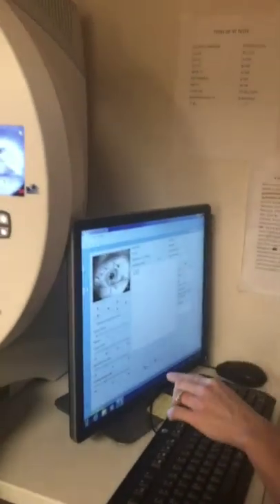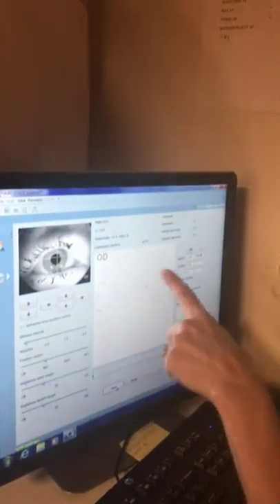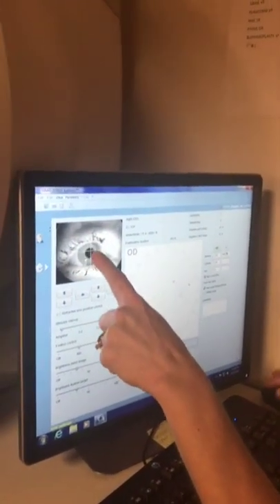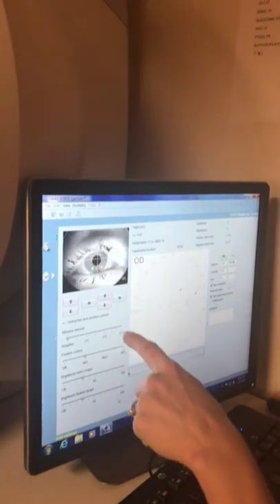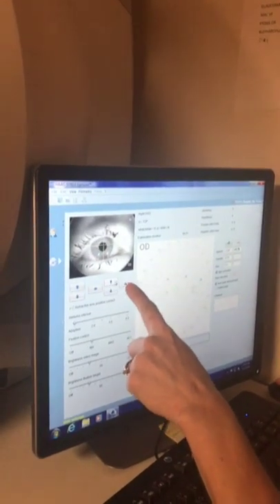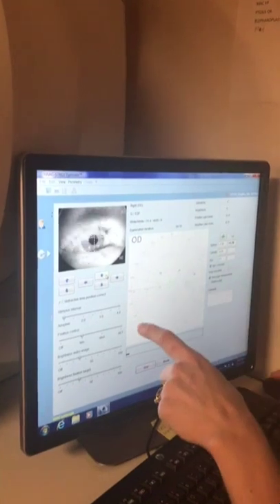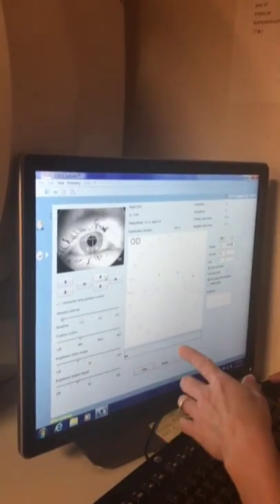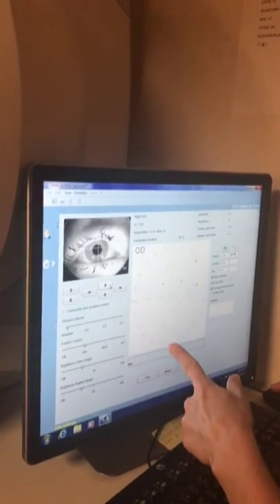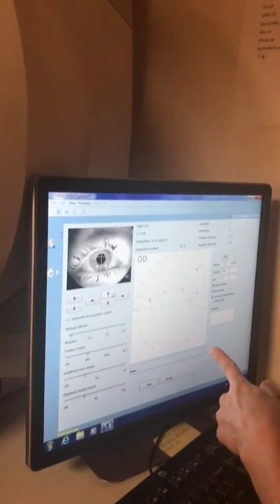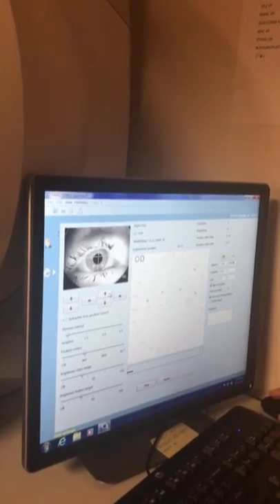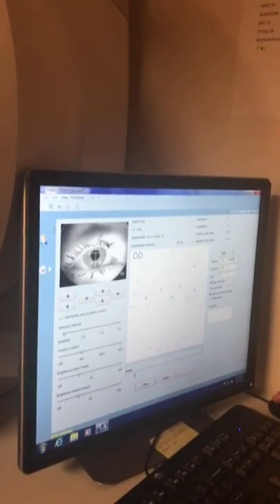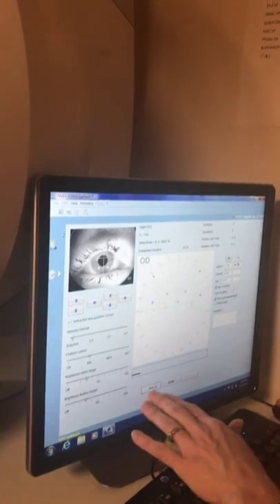And then if you look back on the screen over here, it's going to start going. You need to make sure you keep her in the crosshairs. If you don't have her perfectly lined up, use these to line her up. This is the status bar. Once it gets to right about here, I like to let my patient know that it's halfway finished, and then once it gets to here, it's completed. So we're going to pretend like she's already finished this whole thing, but I'm going to go ahead and hit stop. And then once it does that, you can sit back ma'am, you're done with that first time.